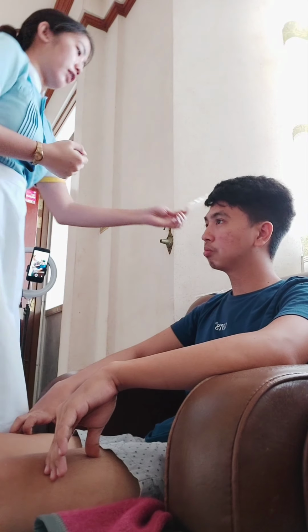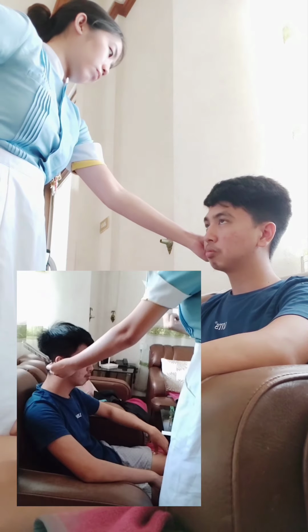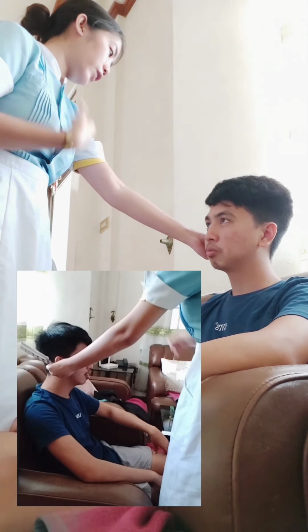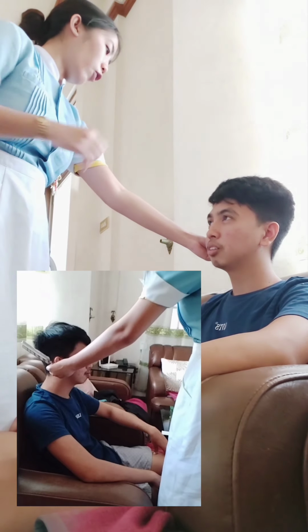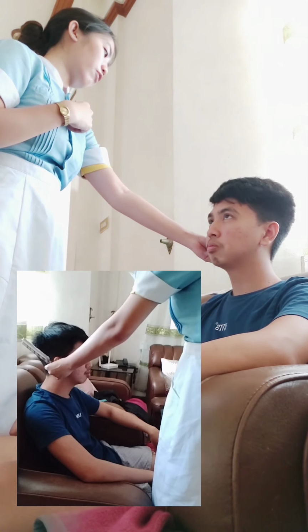Then I'll place it. When you can no longer hear that sound, kindly signal me. Is that okay with you? Yes. Okay, and now I will allow it to stay there for 2 to 3 seconds to allow them to appreciate the intensity of the sound.